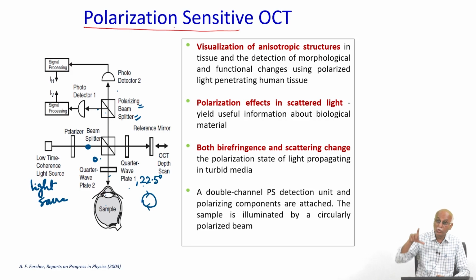However, because its reflection is so large, sometimes it acts as a noise. The intensity for that Z1 surface is such that although the interference pattern may not have a very large effect, the signal is still large enough to act as a noise for the Z3 surface to be identified.